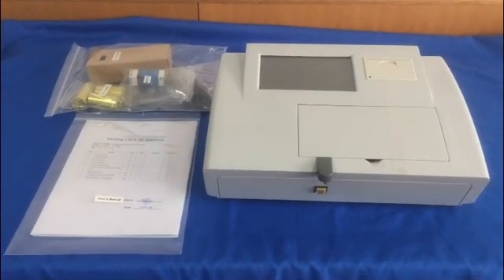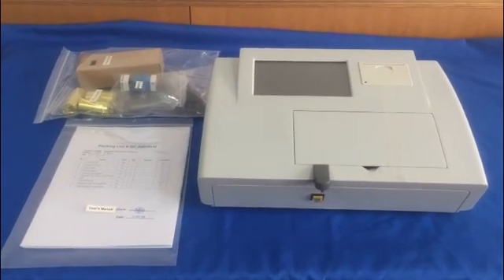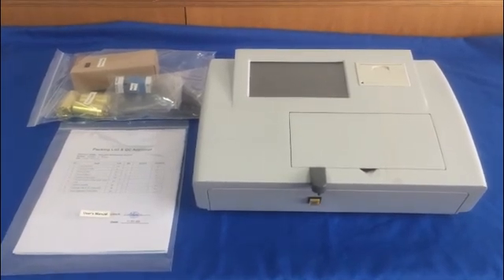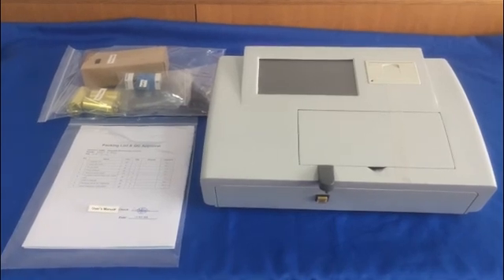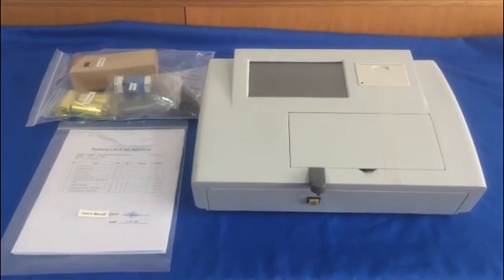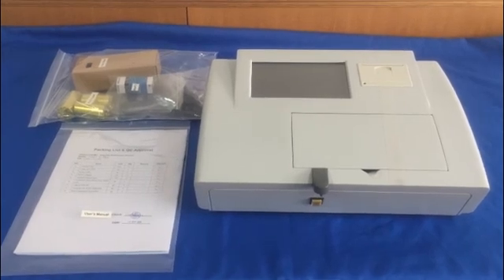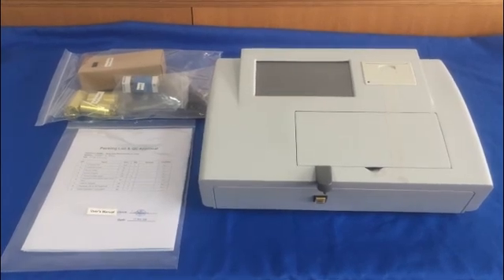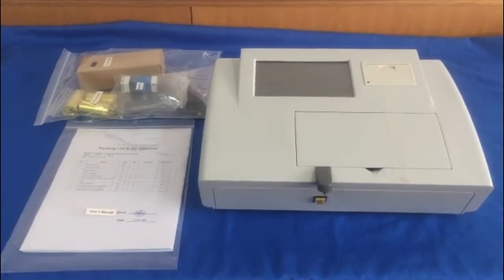This is a semi-auto biochemistry analyzer. Today I will show how to install and operate it. Step 1. Receiving inspection. When you receive the package of the analyzer, take it out of the carton carefully and put it on a horizontal table to check if the appearance of the analyzer is in good condition. Check and confirm whether the instrument accessories are complete according to the packing list.